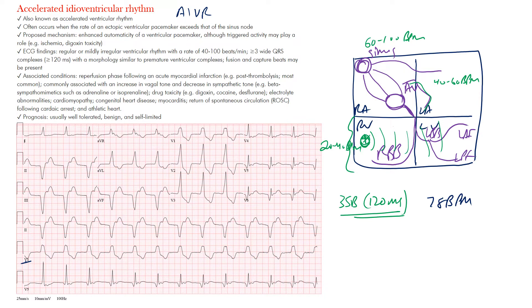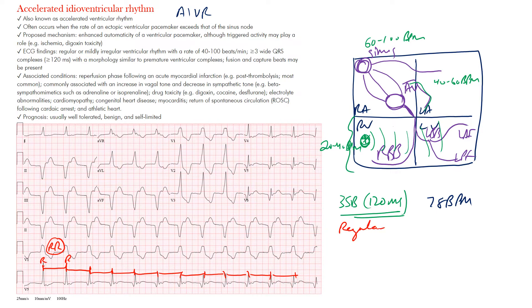The rate is 78 beats per minute and the rhythm is quite regular — the R-to-R intervals are equidistant, so we call this a regular rhythm. Notice there are no P waves preceding these complexes. Lead II and V1 tend to be good leads to look for P waves.